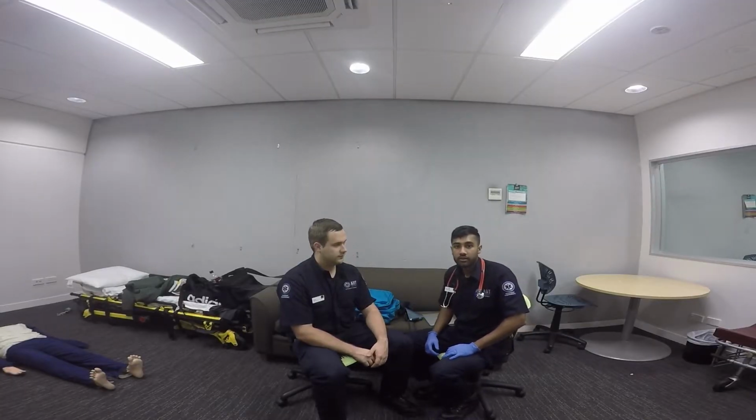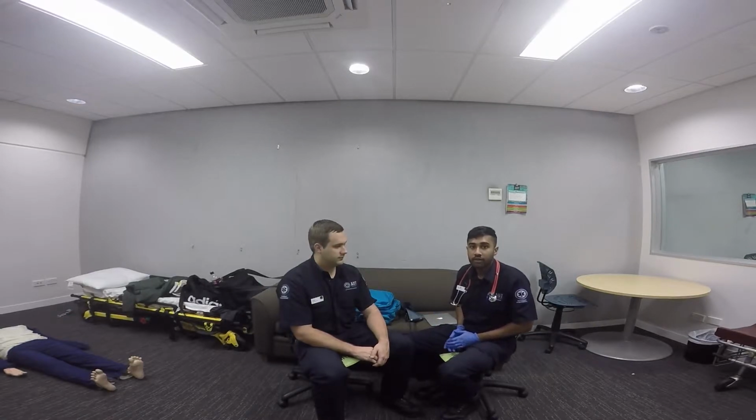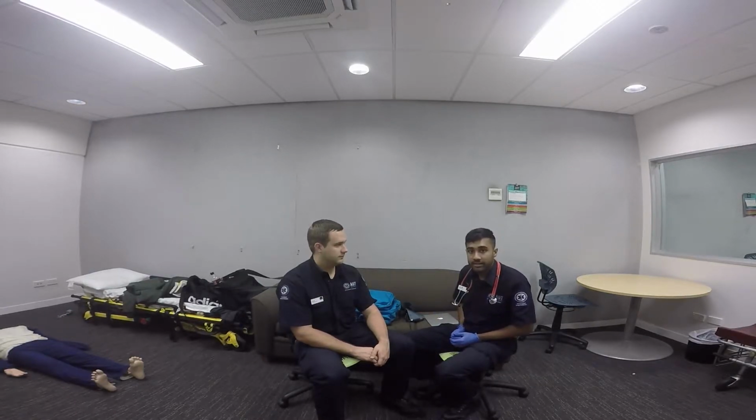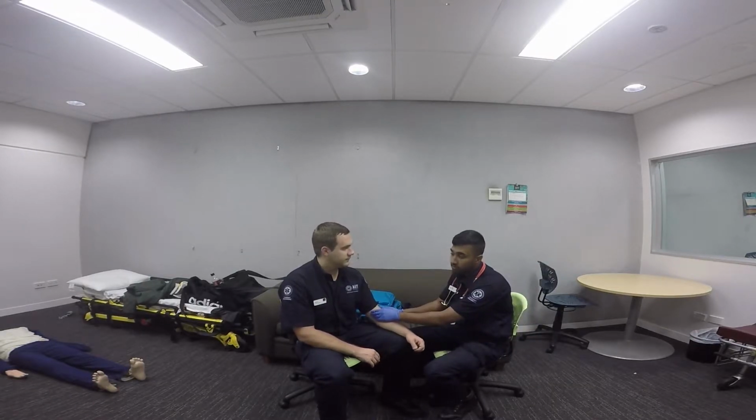Alright, the next vital sign we're going to do is blood pressure. To start that off, we need to ask for the patient's consent. So Martin, is it okay if I take your blood pressure? Yes, that's okay. Alright, thanks mate. You're just going to feel a bit of tightness around your arm over here.